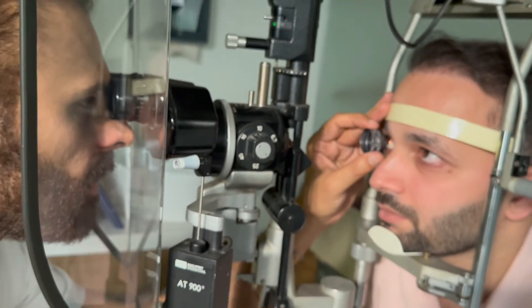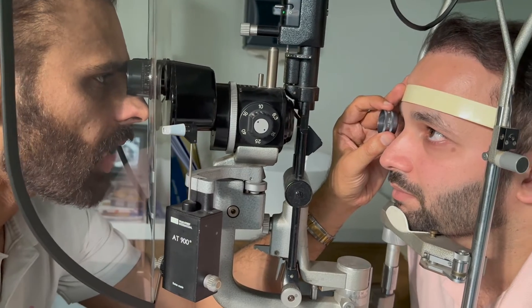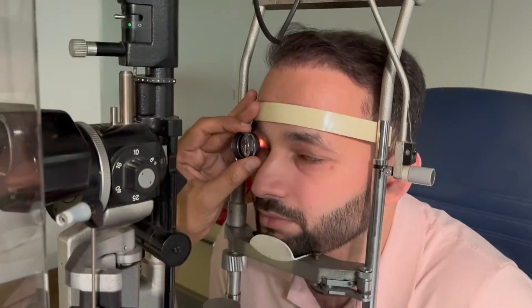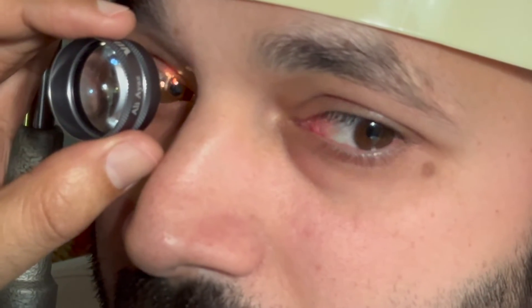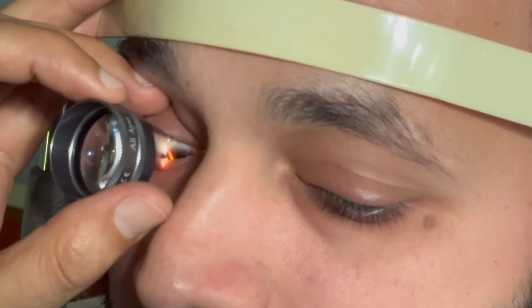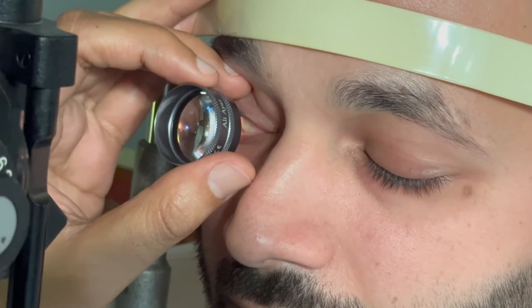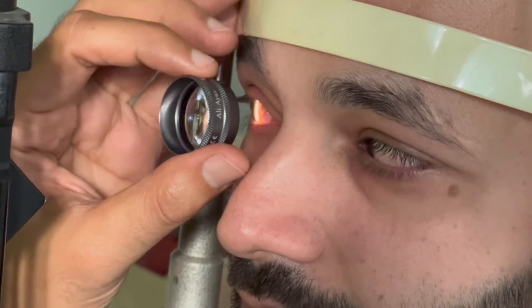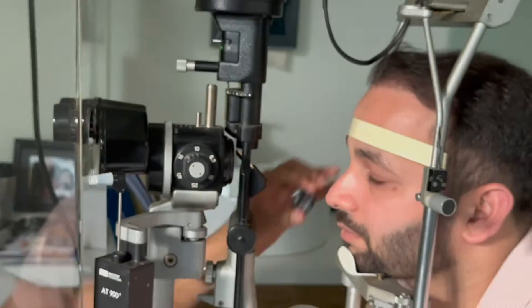To examine the full retina, ask the patient to look up to see the superior retina, then up and left, then left, then left and down, then down, then down and right, then right, then right and up. This is done so that you can see the whole retina in its extremity to the ora serrata.